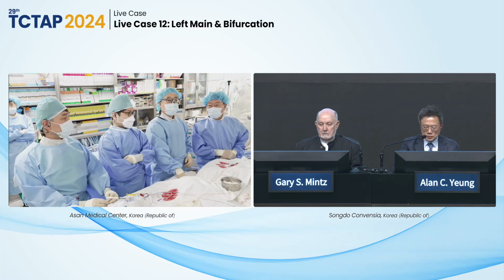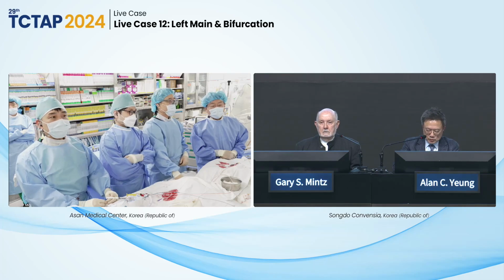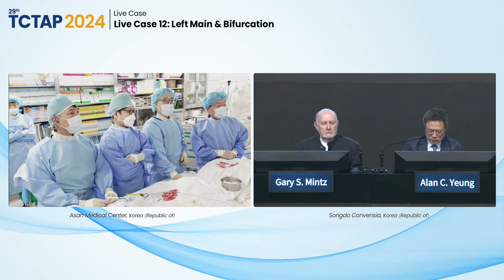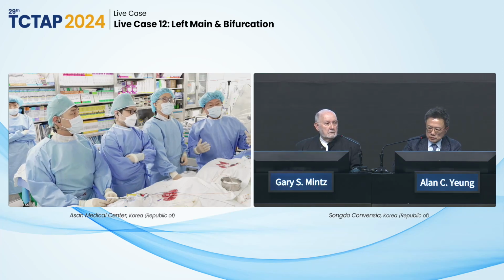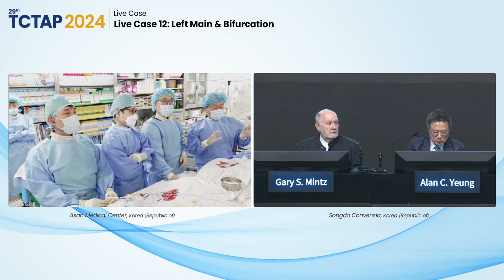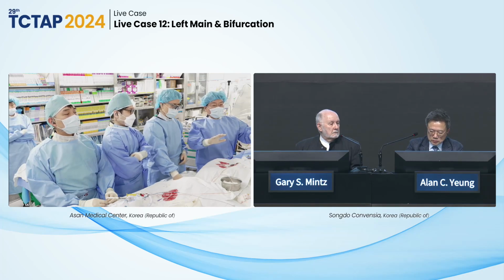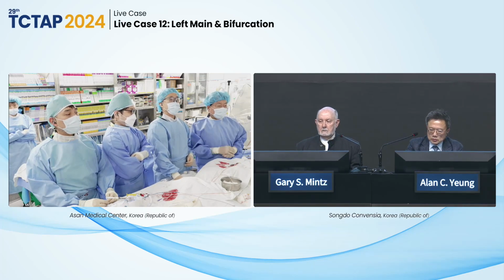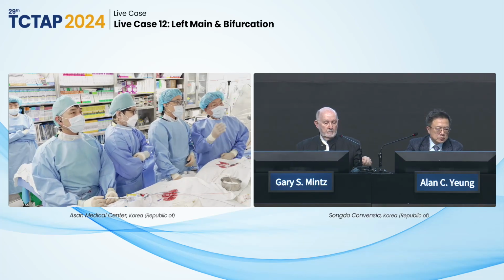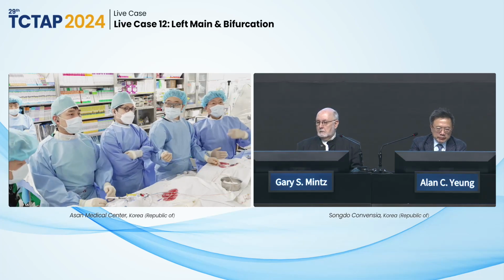Almost there. So we are preparing the last live case demonstration from our hospital. This case is also a left main disease. Yesterday we discussed a lot about the new study. Dr. Bach discussed the main study, angio-guided and FFR-guided. Anyways, we want to make some new data for that. Okay, would you show us the angio first? Yes. And then introduce the case.